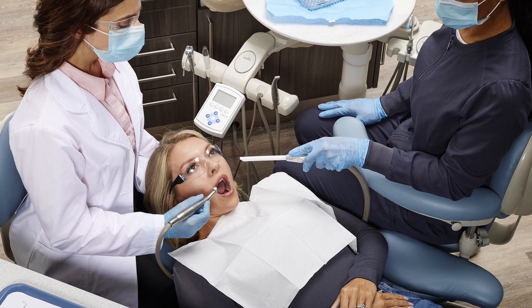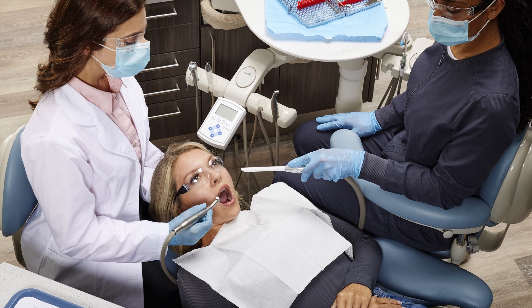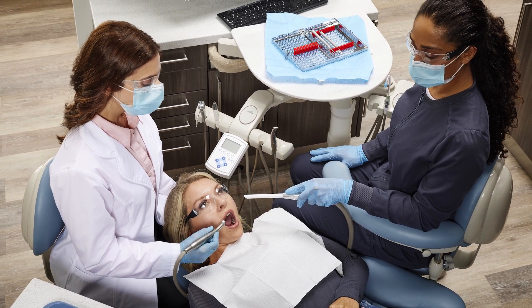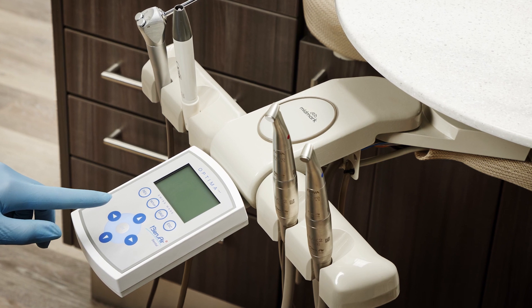Adding more users needing suction at the same time also changes pressure. Everything you do in a dental practice causes changes to pressure, which can be a problem with a blower fan pump. A positive displacement pump will continue to pull suction as pressure increases, providing you with the best performance where it matters the most.